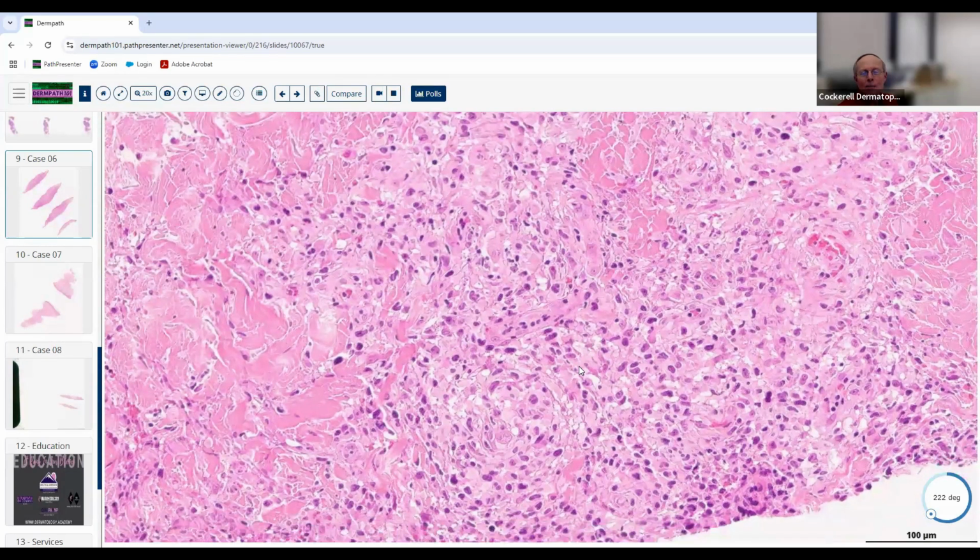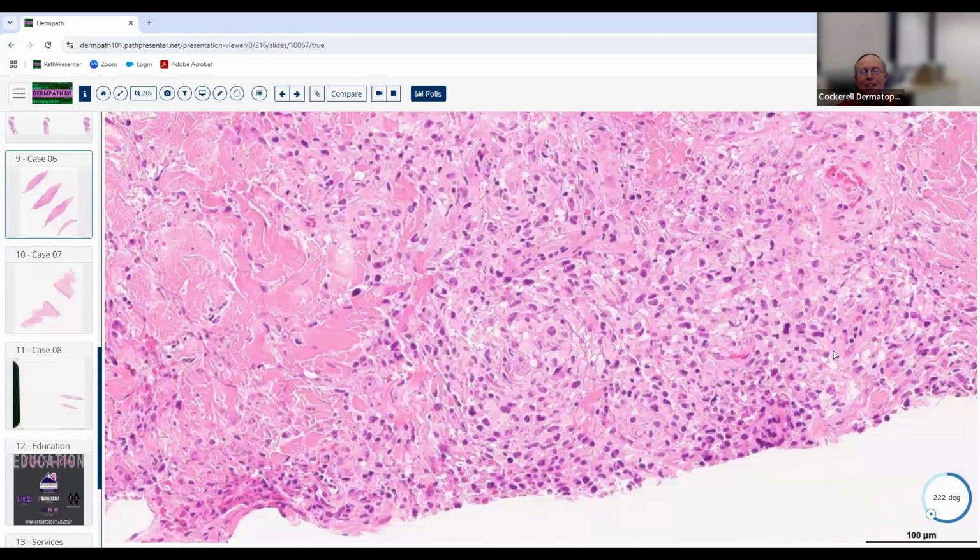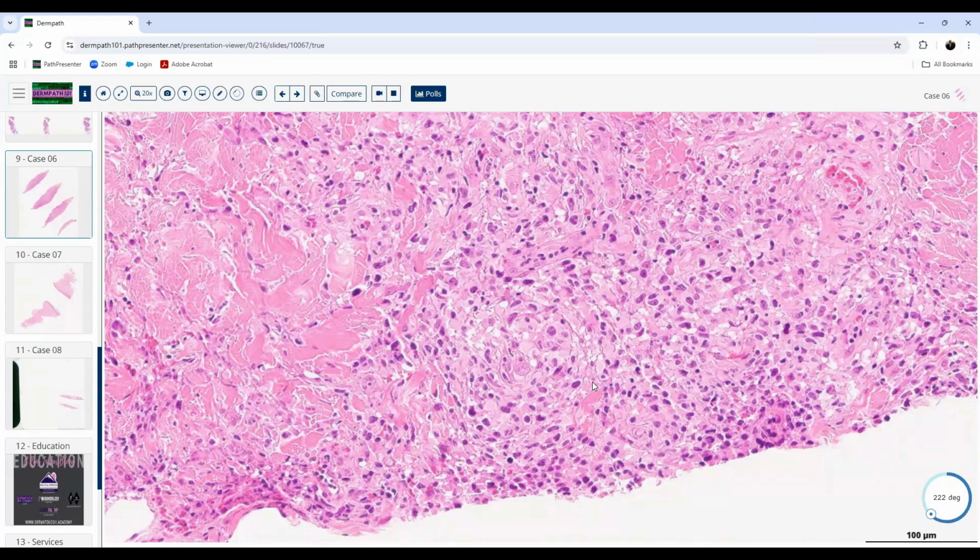This isn't an easy slide. Okay, this is a third year kind of case. So if we were playing a game show, you could dial up a friend or something. Maybe more vacuolar appearing over here. Well, notice how you said atypical.